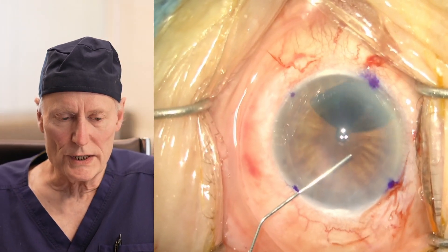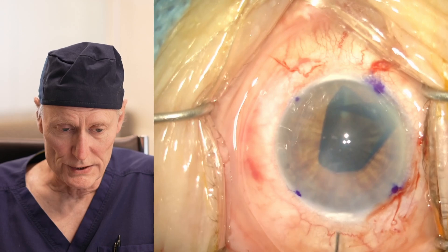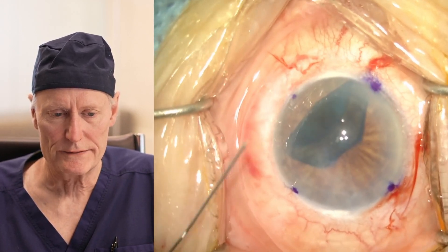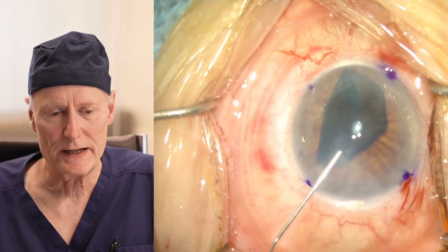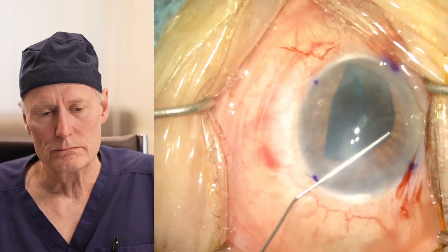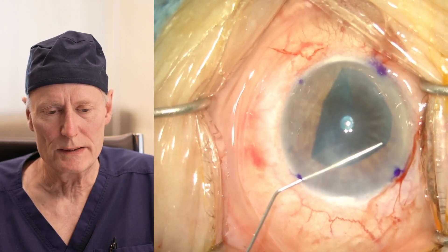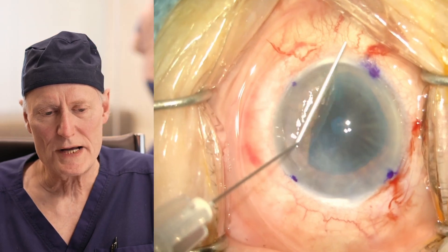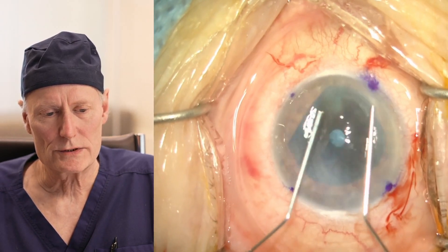We can make sure the tissue is right side up and oriented properly. We inject some little jets of saline, and this allows us to observe the behavior of this layer of cells in the front part of the eye. We can tap on the outside of the eye, and based on the way the cells are curling, we can tell which way is right side up. Then we can slide them over just a little bit, do a little more tapping on the surface, and have them lay down just the way we'd like.